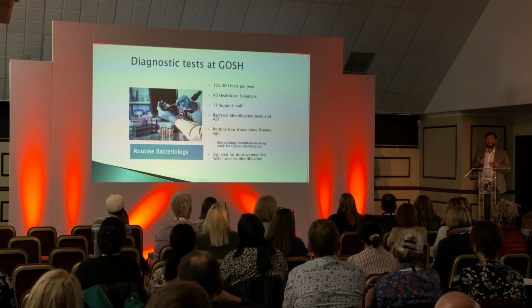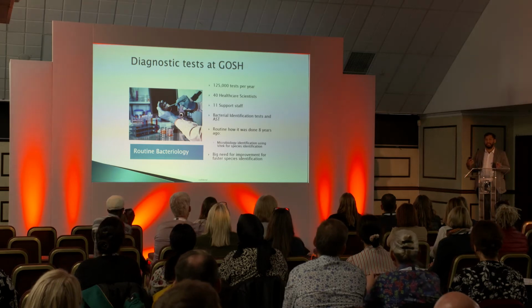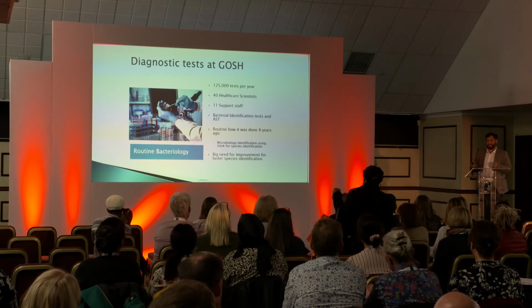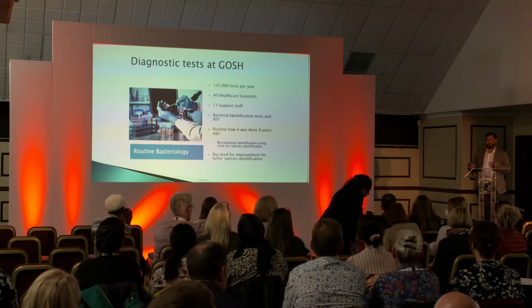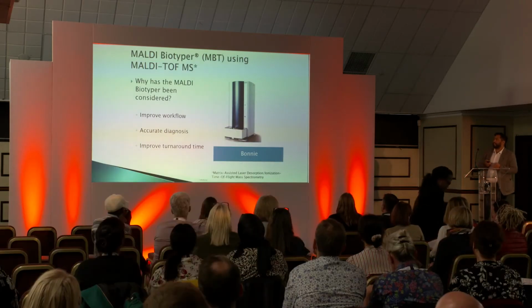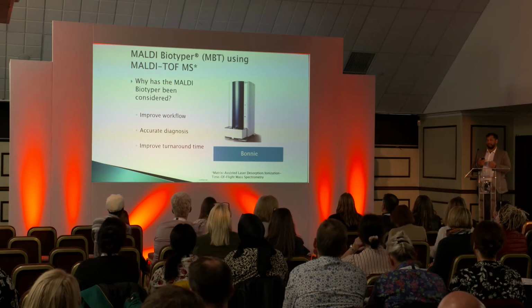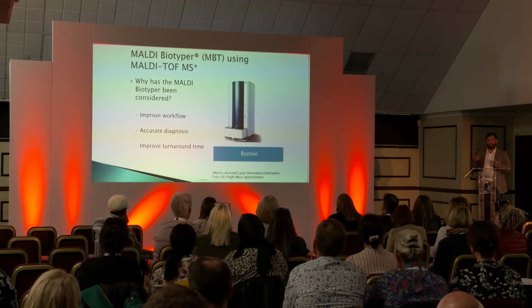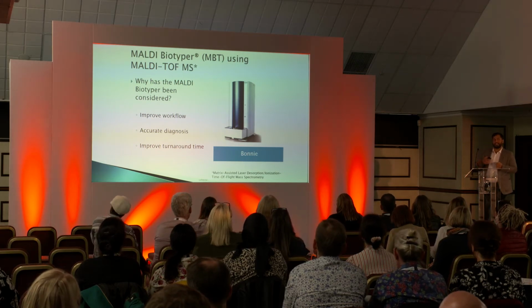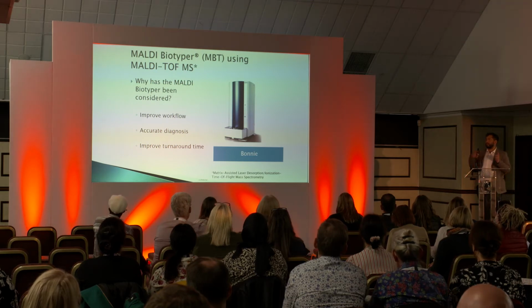So, there was always a need to improve things within our hospital, and particularly when you've got a patient population where they're children, we need to treat them very quickly, rare diseases, you want to try and get a result out as quickly as possible to improve that treatment and management. So basically in 2012, we decided to bring in the MALDI-TOF because looking through the literature and a couple of other hospitals that used it, they showed the benefit of it, which was to reduce the time to identification, which is what we want to do. And it also changes our workflow in the laboratory.